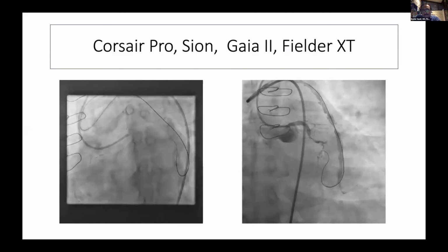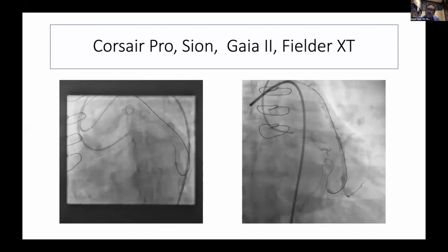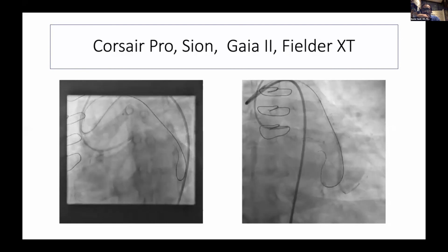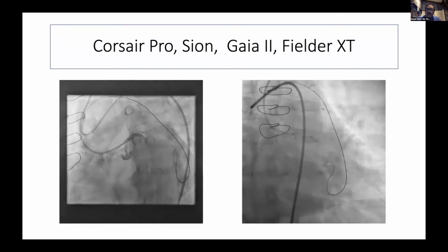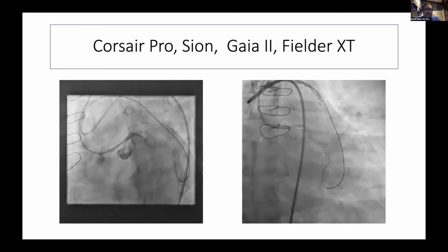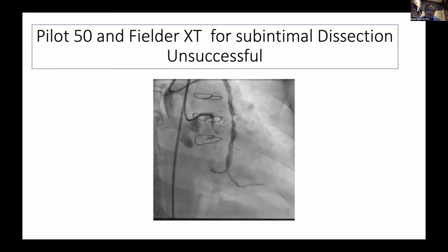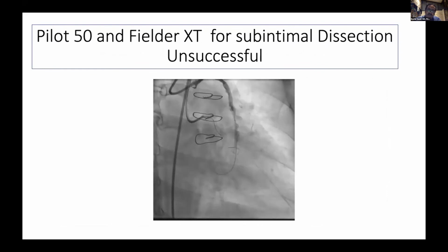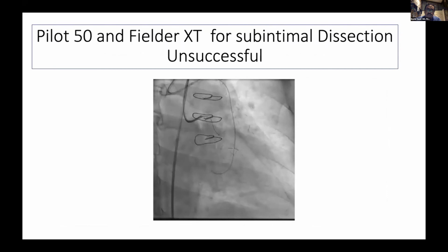At that time, we had spent about half an hour to 45 minutes, and the patient was having pain and also ECG changes. So we decided to abandon at that time and just fix the graft now, just those 3 critical areas. And maybe with this degenerated graft, he's soon going to have worsening of the rest of the graft, and maybe bring him back and try to fix at that time. This is another view in which I tried to get the wire antegradely and retrogradely. The length seemed pretty long, and again the course of that OM native vessel was ambiguous.